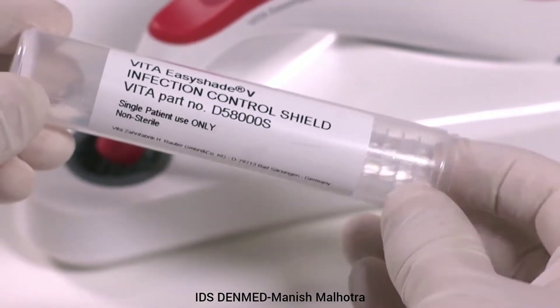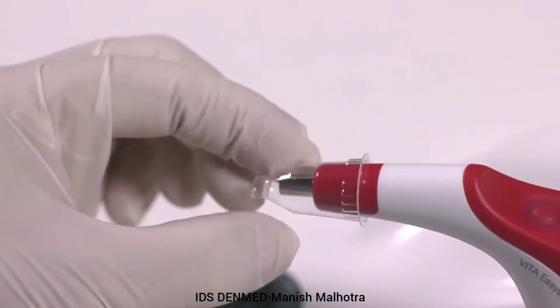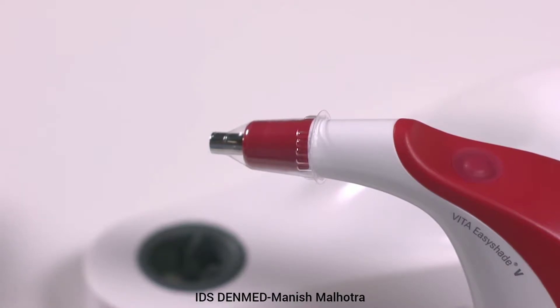Remove the infection control shield from the packaging. Simply slide the shield onto the tip of the device and ensure the shield is flush with the measuring tip.